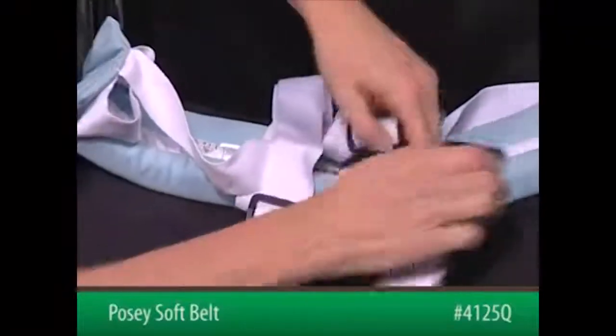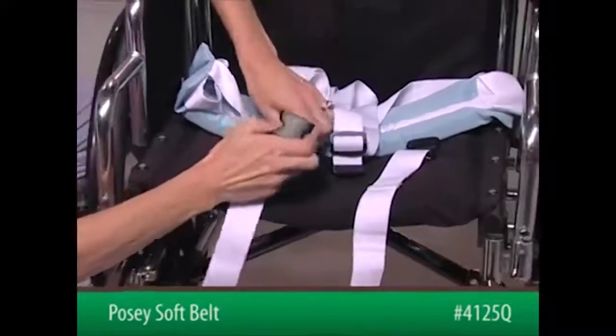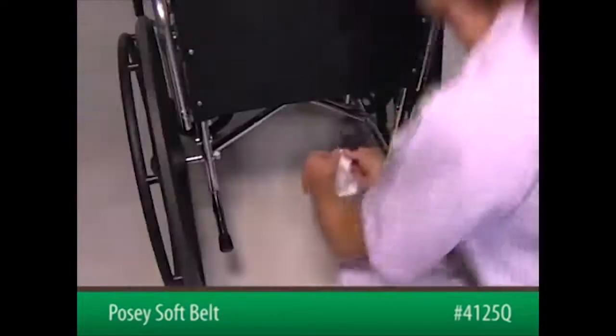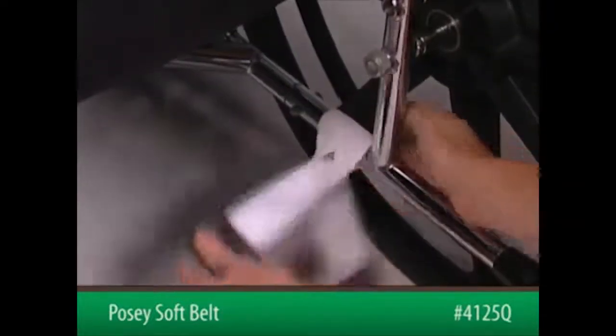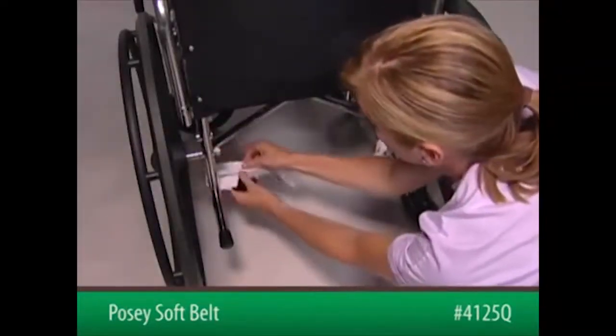To begin, squeeze the quick-release buckles to remove the short ends of each connecting strap. Attach them in front of the rear vertical legs of the wheelchair kick spurs, out of the patient's reach. Secure each strap by feeding the female end of the buckle through the loop in the strap.